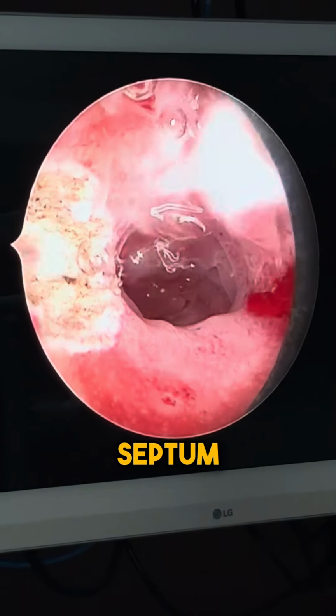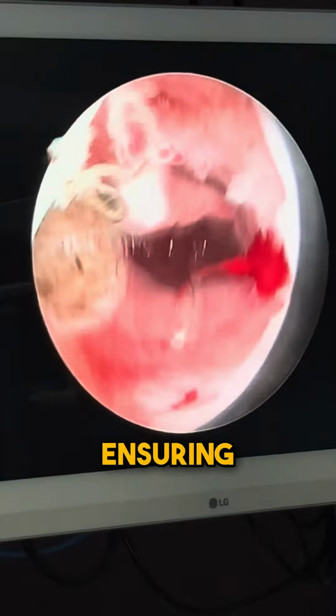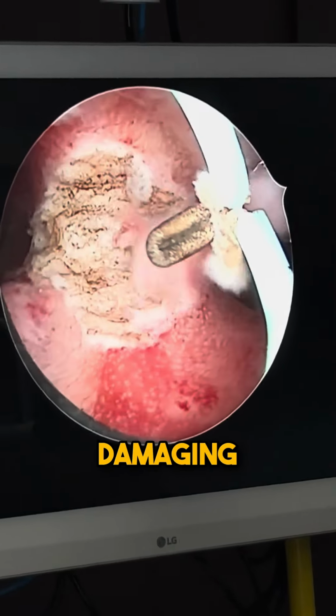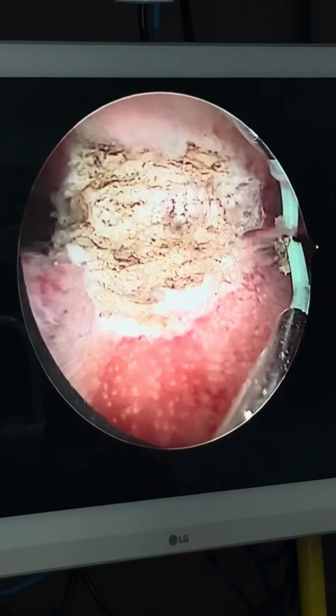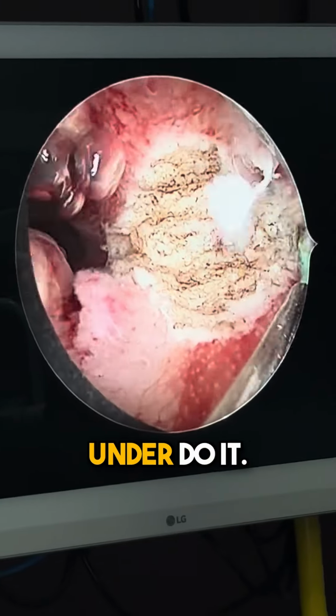The trick of septum resection is not only cutting the septum, but also ensuring that we cut in the same plane without damaging additional layers of the endometrium, and also ensuring that we don't overdo it as well as we don't underdo it.